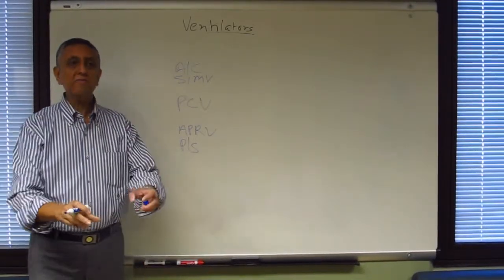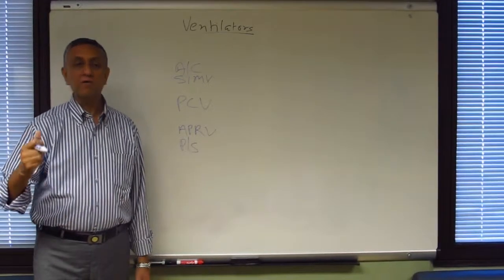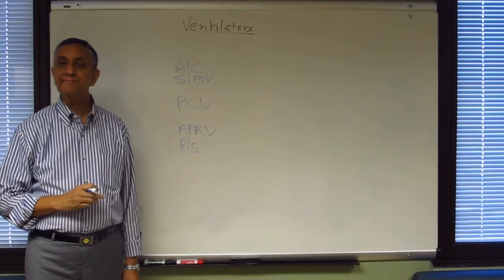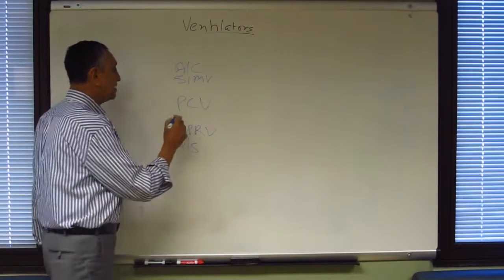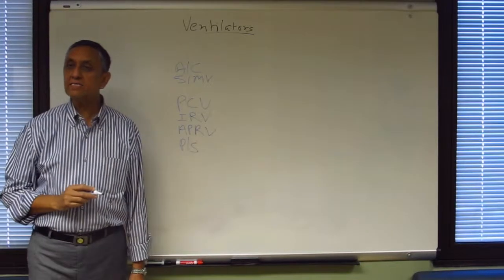What else do you dial in from the machines? Besides, I'm not talking about rate, FiO2 or tidal volume, but everything else. The inspiratory time. Sorry? The inspiratory time. That will come in another way. It's called IRV. Do you know what that stands for?